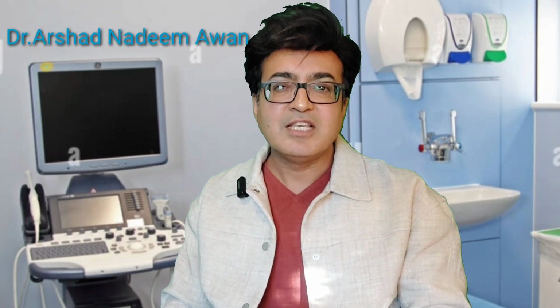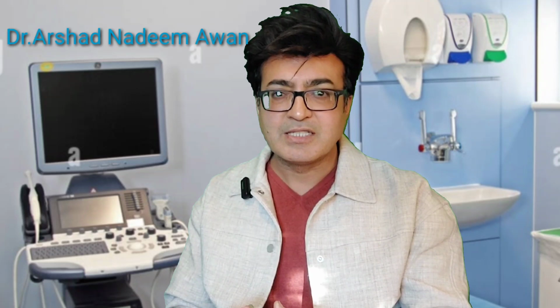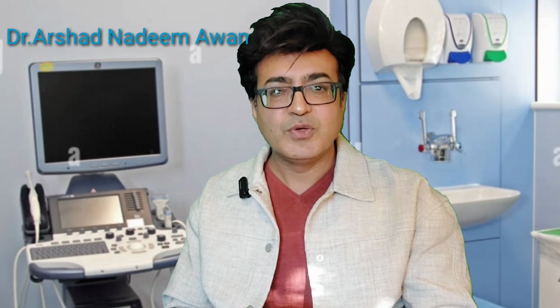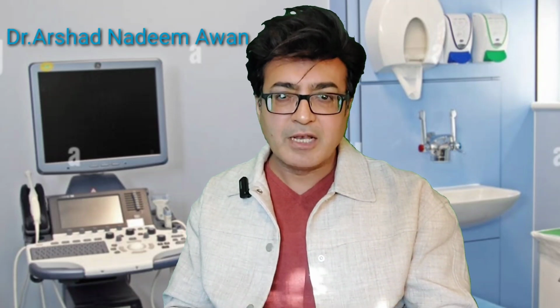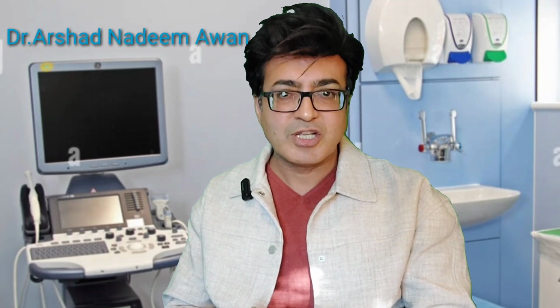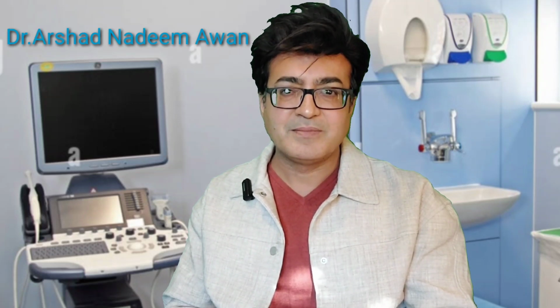The pathological processes will be covered in a separate video. This one is particularly about the urinary system, including kidney, ureter and bladder, how it appears on ultrasound imaging, how we appreciate all these components, and what the normal parameters are. I will also discuss the normal variants of the kidneys, ureter and bladder. So all this will be included in this lecture. Let's start looking at the normal structures we can appreciate on ultrasound imaging related to the kidney, ureter and bladder.